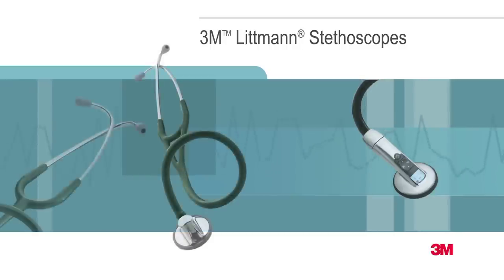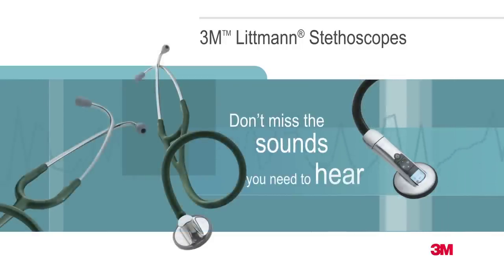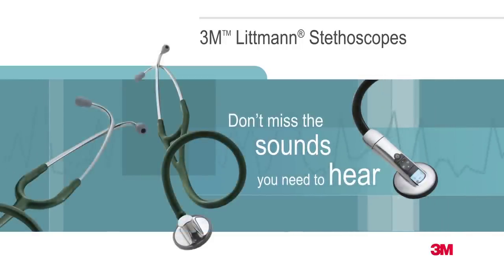The 3M Littmann brand is synonymous with exceptional auscultation, comfort, design, and variety.